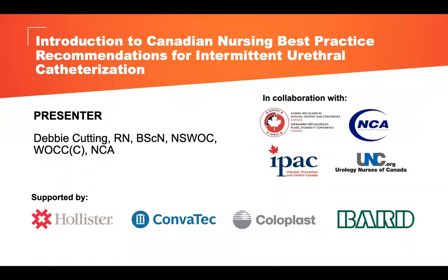With any of the catheters, particularly the hydrophilic coated ones, every time you re-sterilize or clean it, you're stripping away the lining. You may not be able to see it with the naked eye, but you're actually degrading the material. As a result, you're going to lose its lubriciousness, and it's more prone to causing trauma because it has lost its surface integrity.